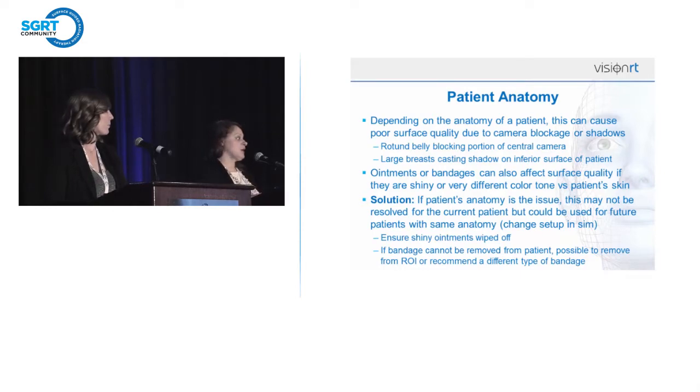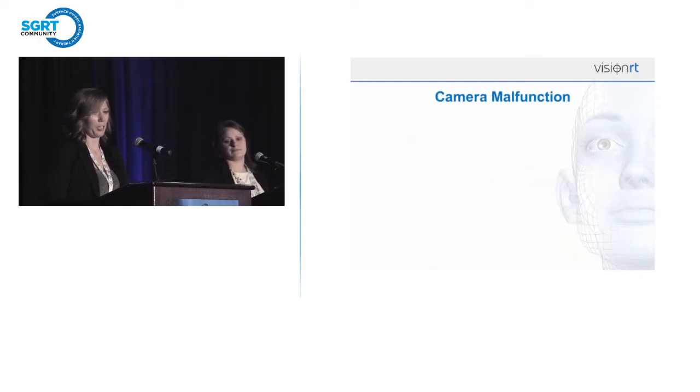If you have shiny ointments, make sure the patient is wiping them off before treatment. And if your bandage can't be removed from the patient, just tell them that next time they get a dressing change, they could maybe select a different bandage, or you can remove that from the ROI to see if you get better results. If, God forbid, your camera malfunctions.